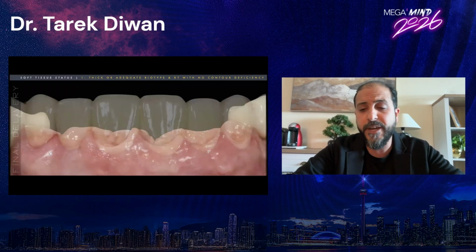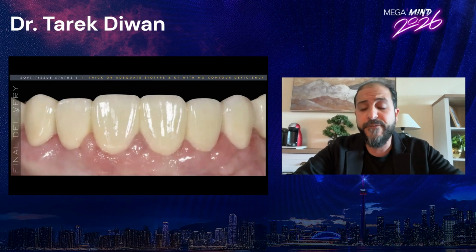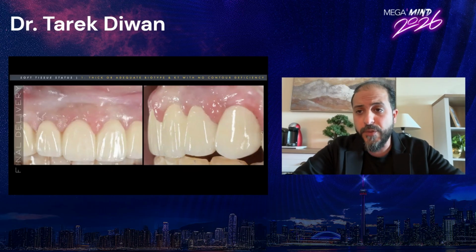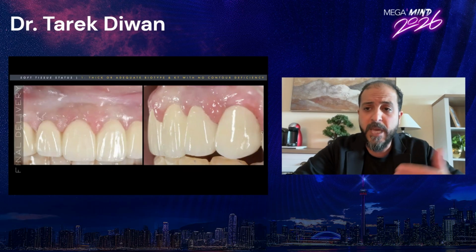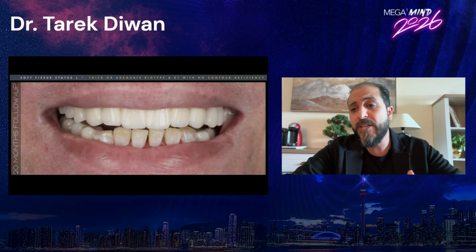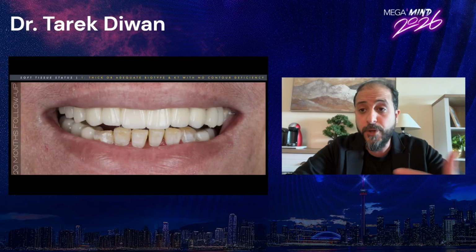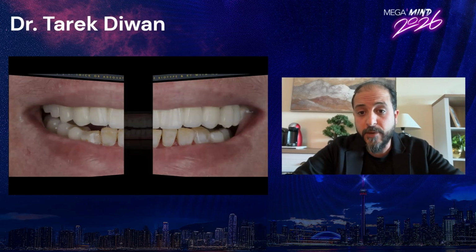From there, we took the final impressions and delivered the final bridge on top of the implants. And that is how it looked on the day of delivery. You can even notice some inflammatory spots still showing on the soft tissue, which just needed much more time to mature. Then the patient disappeared and showed up again at 20 months. So it was time to check how the tissue had matured so far, time to remove the curtains and check how the tissue is looking right now.